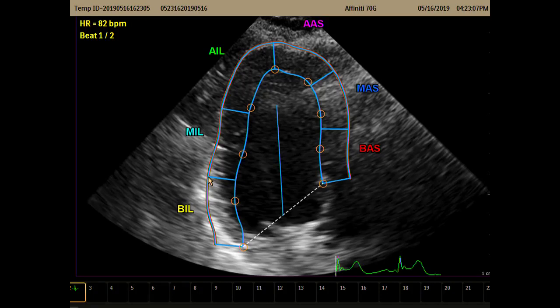You want to exclude it. This looks a little bit better to my eye. Again, this is something you just got to play with. You got to get your machine, get like a medical student, get a healthy subject, and play with it.